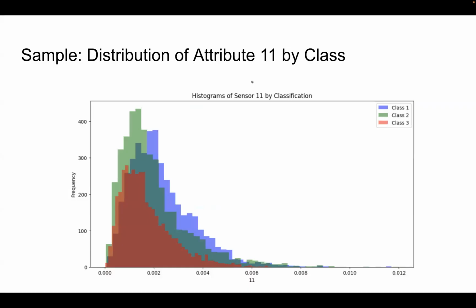Here they have been normalized and plotted in histograms via a specific amount of buckets, and they are graphed on top of each other so that you can see the variance in distribution between some of the attributes.